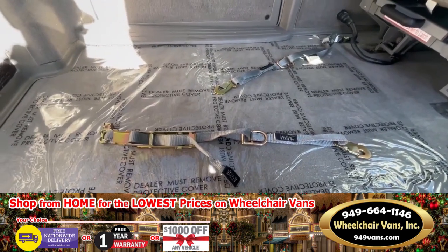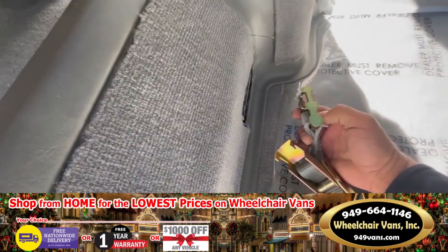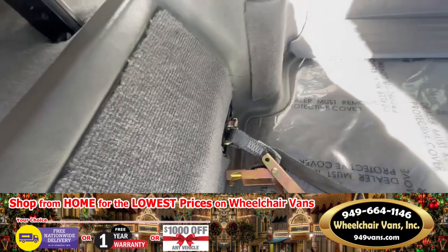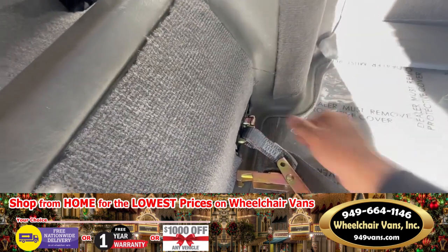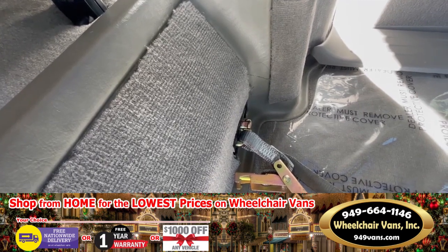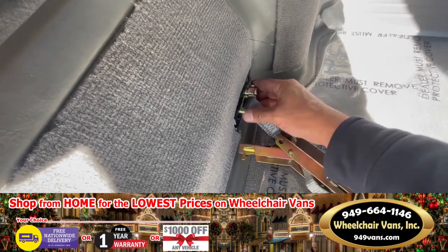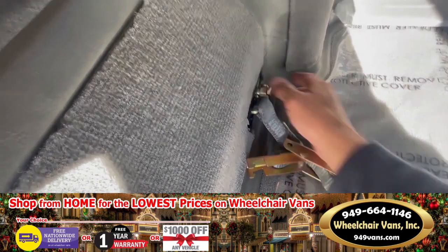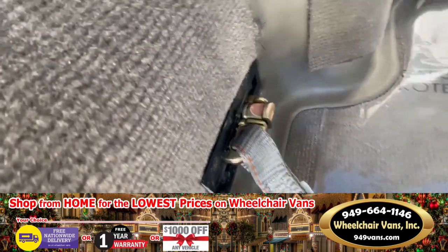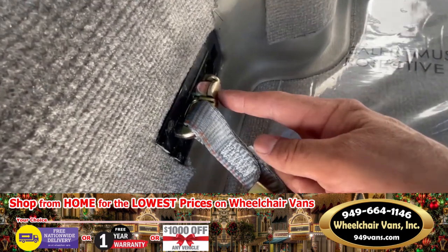Installing these particular wheelchair securement systems within the vehicle is fairly simple. You're going to take the golden teeth, match it, and simply push down and slide. You'll notice this particular item went all the way down, which confirms that it is secured. If the product is left so that the tab has not been fully pushed in, it is not secure — you have to make sure that tab goes all the way down.